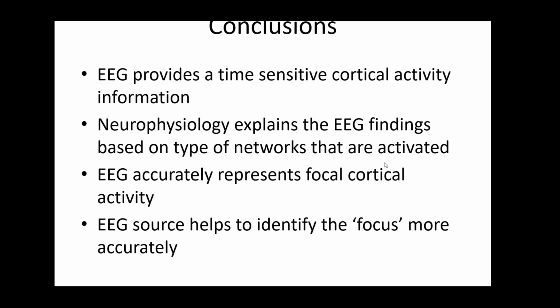Like I explained in the talk, the alpha rhythm is the posterior thalamus in an alpha frequency. And then for the rest of the frequencies, because those ranges are so large, it could be either theta or delta range that you see in drowsiness and sleep. So those are the main frequencies that you can deduce: if you see an activity that is very slow, it's likely because the network is very large, and the largest networks are usually thalamocortical networks.